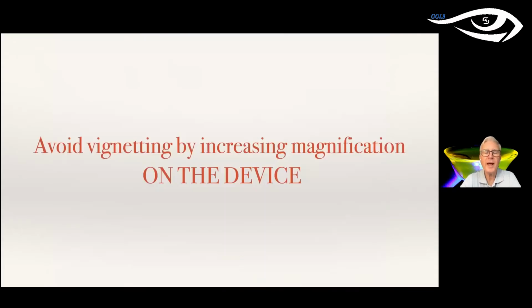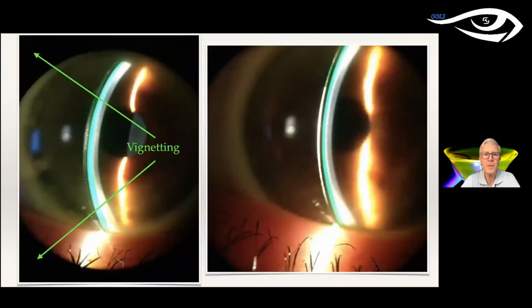All right, one thing I see a lot in amateur photography, even in magazines, is vignetting. And we're optometrists, so we know that vignetting means that we're cutting off the side, the periphery of the picture. So this is what I mean by vignetting. You take a picture and you see all this black around it, so it looks like you're looking down a tube or a straw. And what you want is the image more on the right.